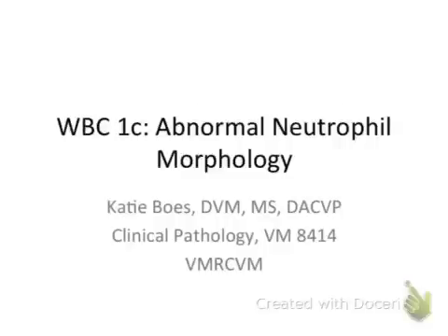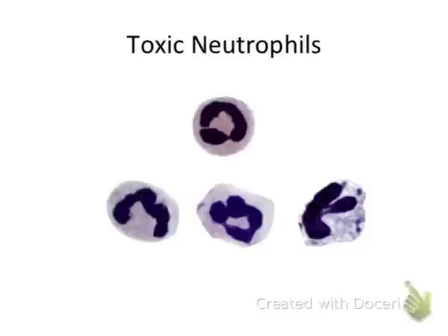Hi everyone, this lecture is going to be on abnormal neutrophil morphology. Toxicity is a morphologic change that is observed on microscopic blood smear evaluation of neutrophils.